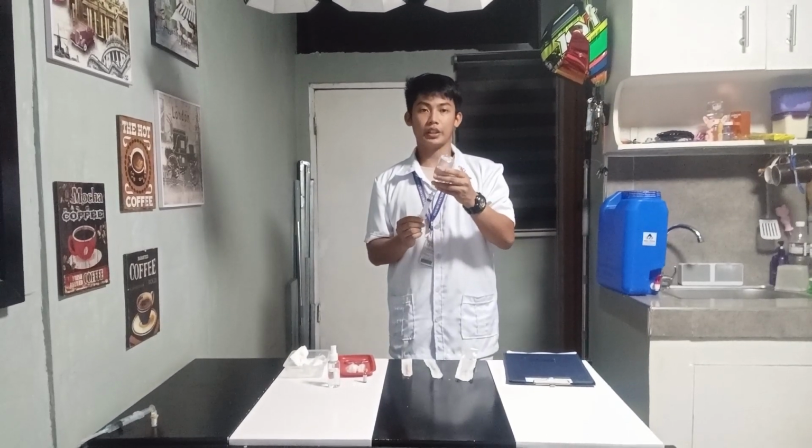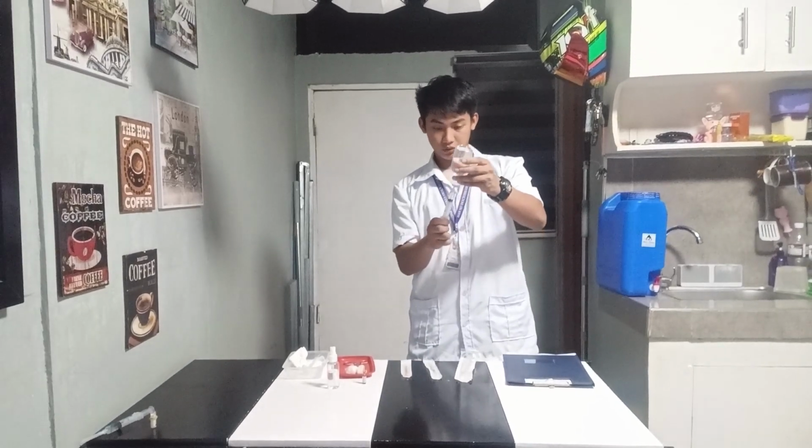Hold the vial down, making sure that the tip of the needle is below the fluid level, since keeping the needle tip below the fluid level is helpful in order to prevent withdrawing air. Now recap and dispose of the filter needle into the sharps container, and then we have to replace the needle that will be in use for the administering of medications.